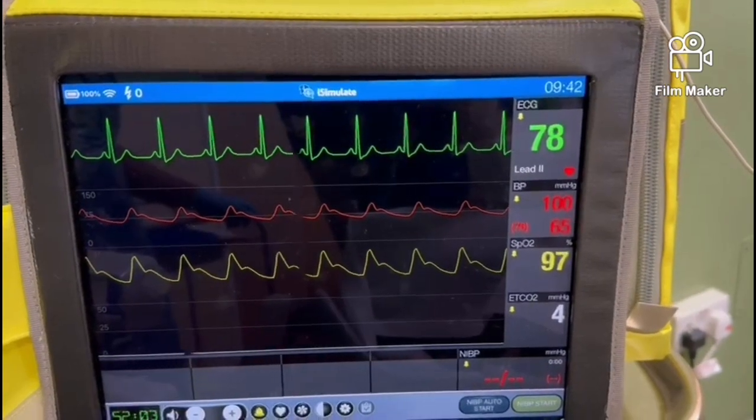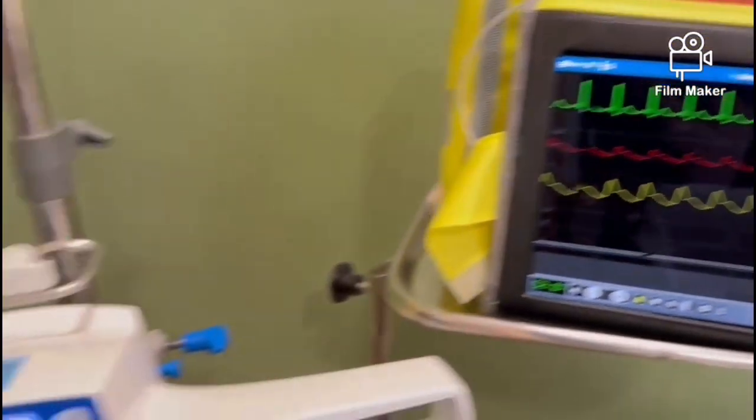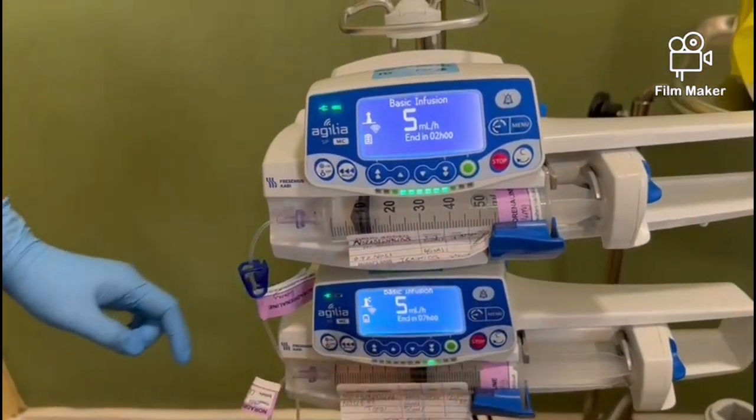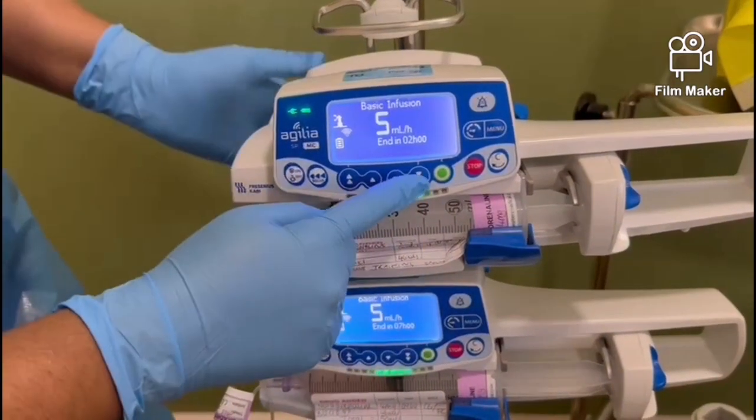The SOP states we should see a rise in 10 mm of mercury in the systolic blood pressure before you halve the rate of the old noradrenaline infusion. Here we will reduce the infusion to 2.5.